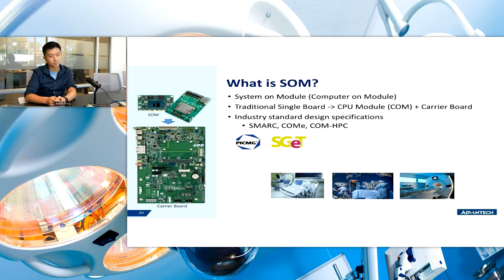Recently I stopped by a major medical hardware manufacturer to which we were selling single board computers, so 3.5-inch SBCs. And I was surprised to see that they were actually not familiar with system on module technology at all. So I figured I would share with you guys the benefits of it. So essentially, it's system on module or COM, computer on module. It's breaking off the compute from the I/O portion of the motherboard. So it's not just the motherboard, we're taking the compute portion off of it, okay?